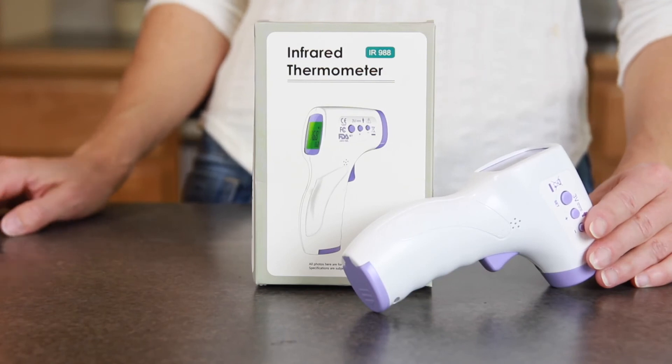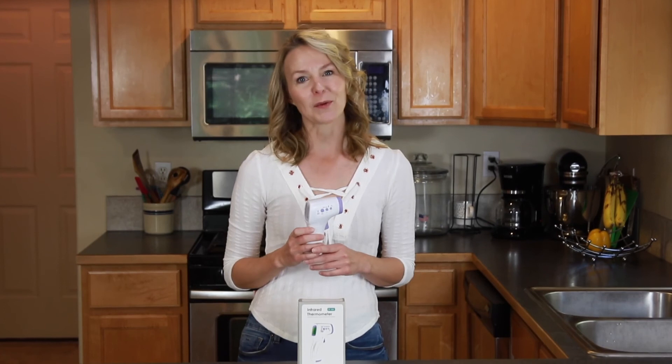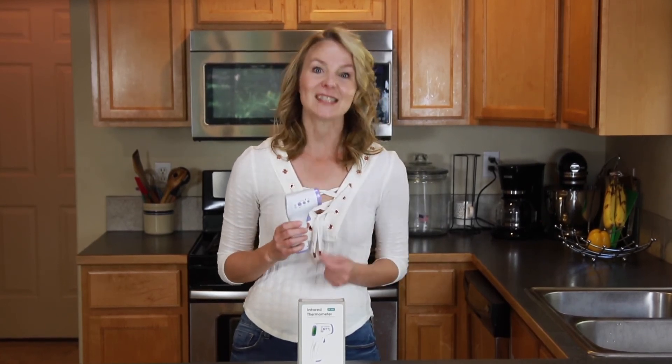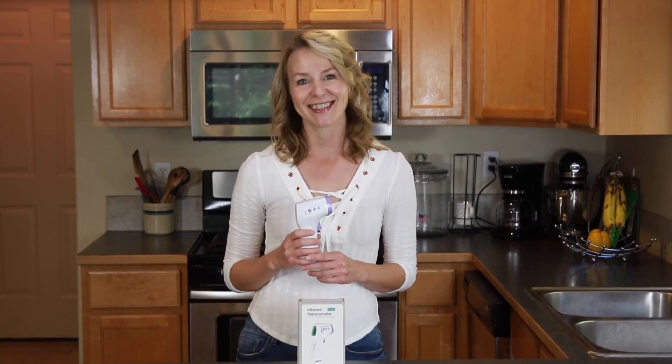We're all doing our part right now to protect our communities. Using an infrared thermometer like this one from Pure Thermo is a convenient way to speed up testing and reduce the risk of cross-contamination. Bye bye.